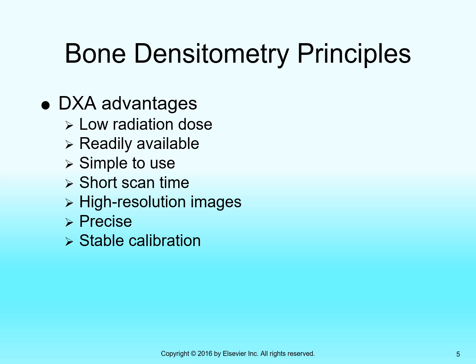It doesn't expand much. Bone densitometry is readily available. It is very cheap and easy to install these machines. The machines are not very costly. They are unitaskers. They're not as versatile as any other imaging equipment. They can only really do this one exam, but they're specifically built to do the bone densitometry exam. Okay, they're simple to use.